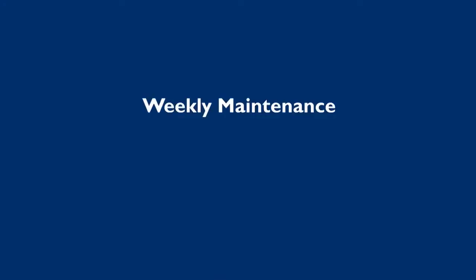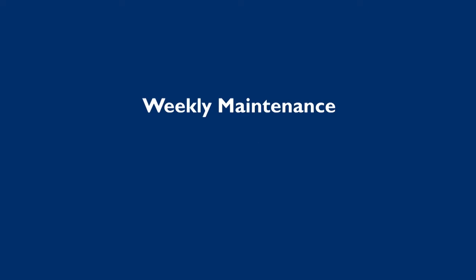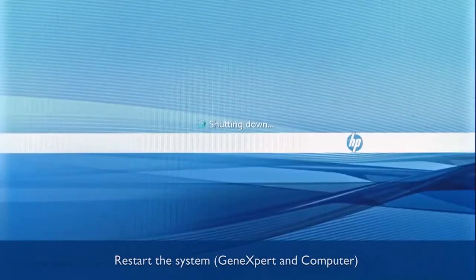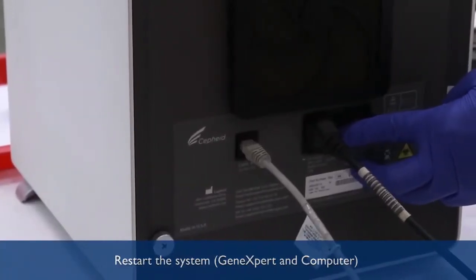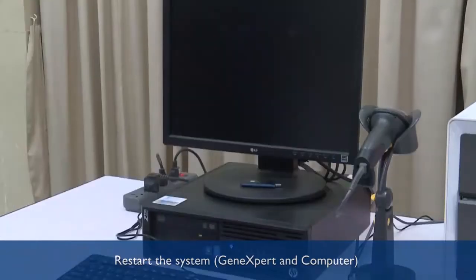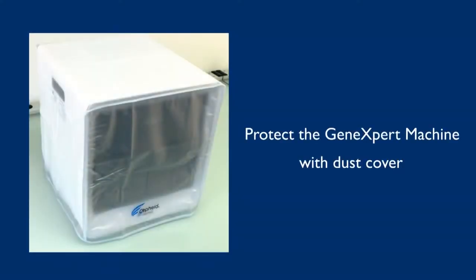For weekly maintenance, we have to reboot the GeneXpert system. Always switch off the GeneXpert computer first, and then switch off the GeneXpert system. Wait 10 seconds, then restart the GeneXpert machine first, followed by the GeneXpert computer. This will complete the weekly maintenance procedure. Always remember to switch off the GeneXpert system when not in use, and put the dust cover on when the system is not in use.